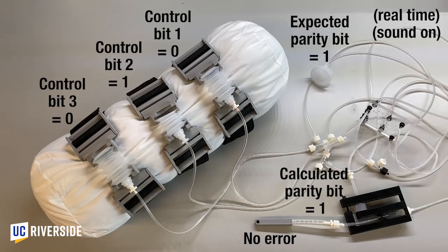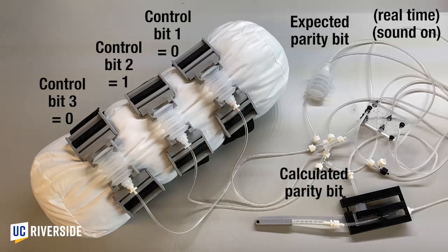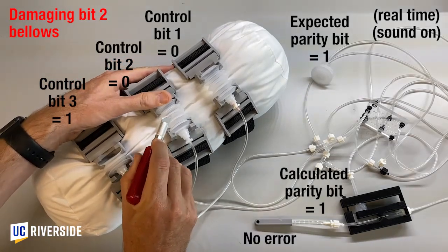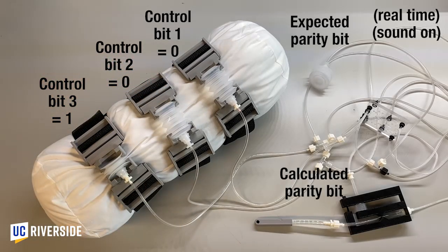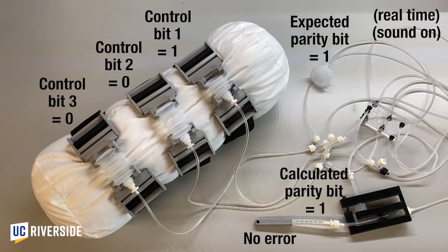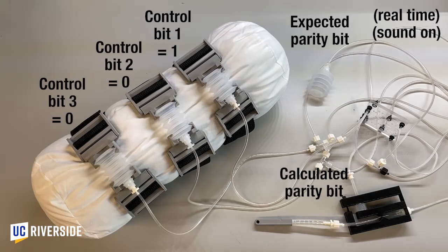Now, after this step, we will use a razor blade to puncture the bellows connected to control bit 2. This simulates the kind of damage to the device that would render it inoperable and require the attention of the user. When the controller tries to apply vacuum to control bit 2 in the next step, that vacuum is vented through the puncture in the bellows. This causes the pneumatic error detector to calculate a parity bit of 0, which disagrees with the expected parity bit of 1. The resulting error signal from the error detector causes the whistle to be blown.